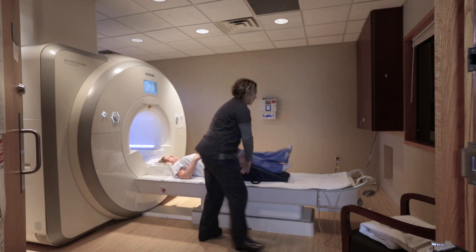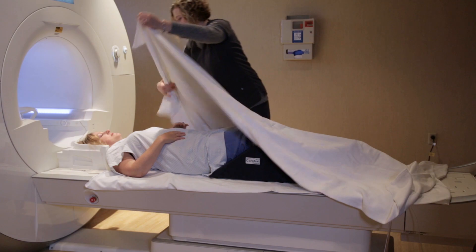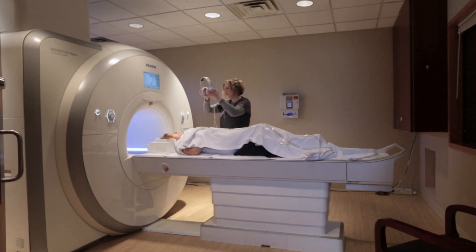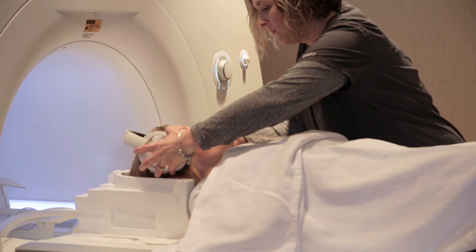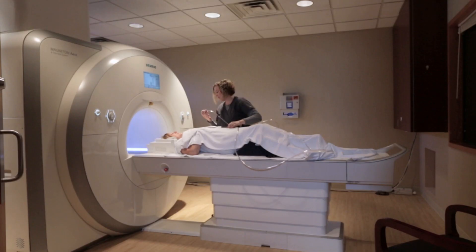When you come in to have an MR procedure of the head, we're going to have you laying on the table on your back. Your head's going to be resting in a cushion inside of a head coil. We're going to be giving you some headphones to help reduce the sound of the machine, and we'll give you some music to listen to.